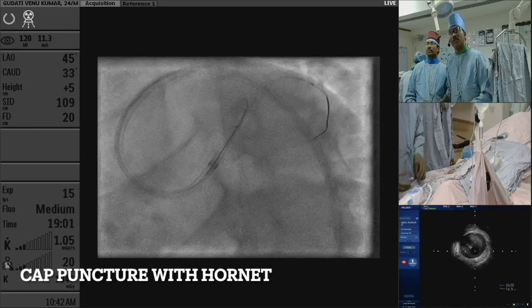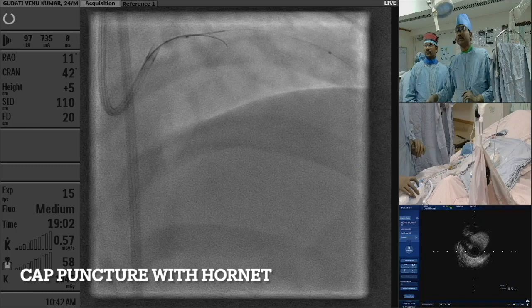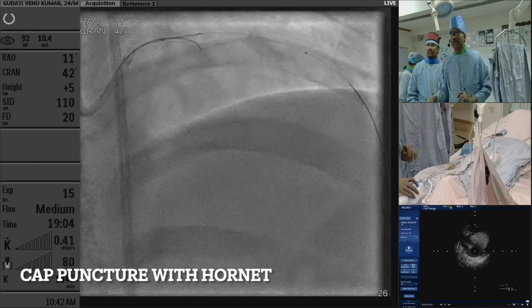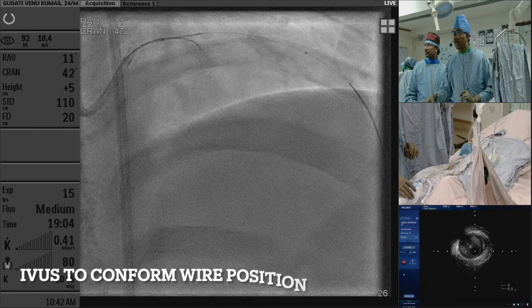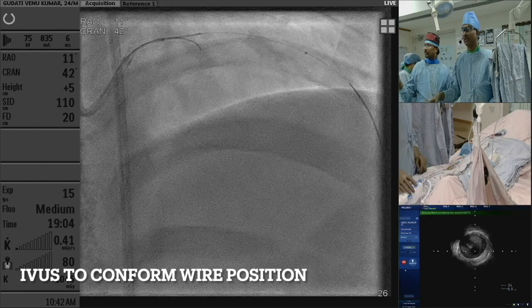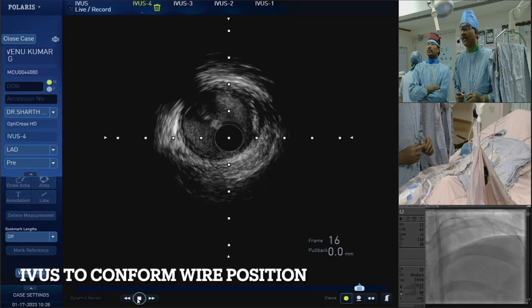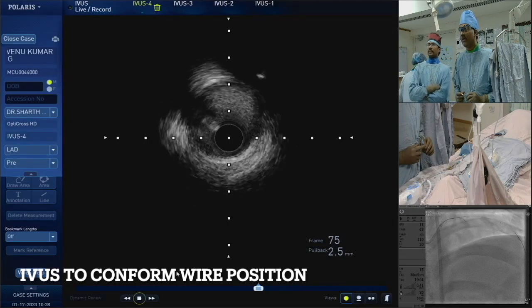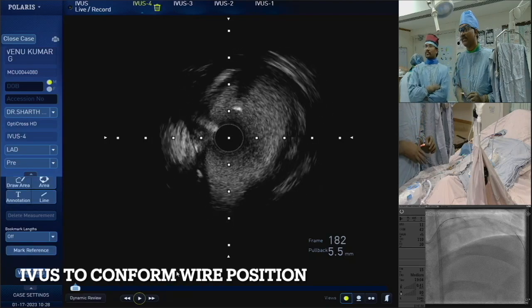Okay. Now just go to cranial. We can just do one recording here. I'll just do a recording here. Auto will just stop. Yeah, now you can see. Stop. So you can see that. See, that's a clear position we achieved.